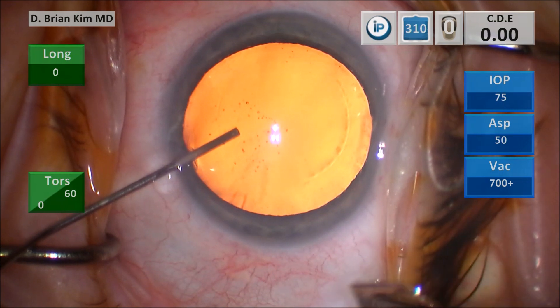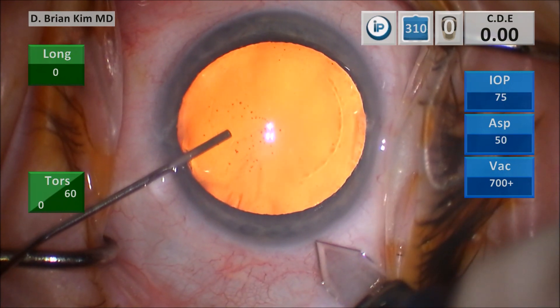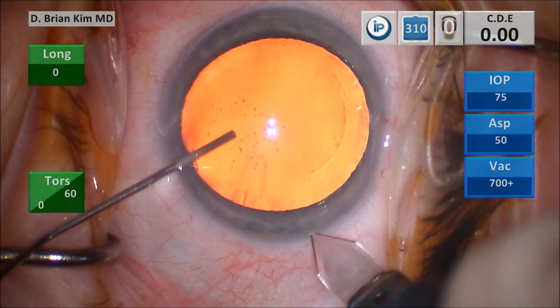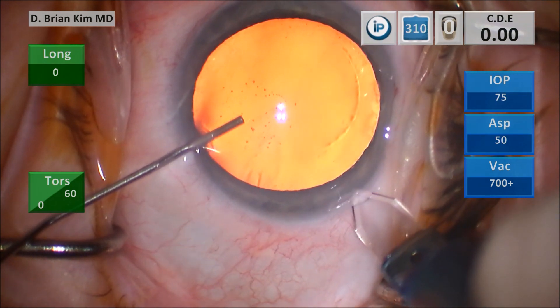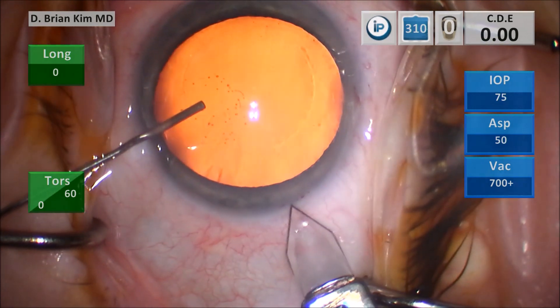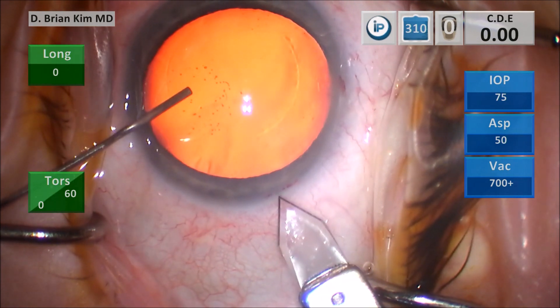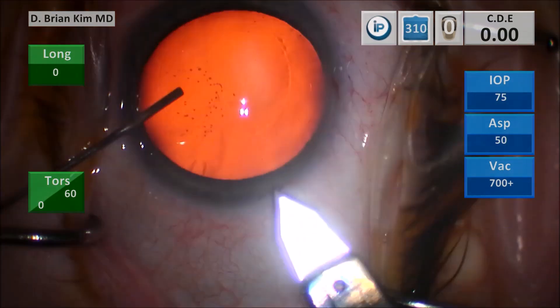Using a cannula does a couple of things. With a fixation ring, you can feel some discomfort from the prongs, so the patient moves and you can have a subconjunctival hemorrhage or an abrasion. But with this cannula technique, it's basically a no-touch technique and you're already in the eye with a cannula anyway, so I believe it's more efficient. I like to keep the cannula not too deep into the eye because if the patient does move suddenly, I don't want to hit the anterior capsule.